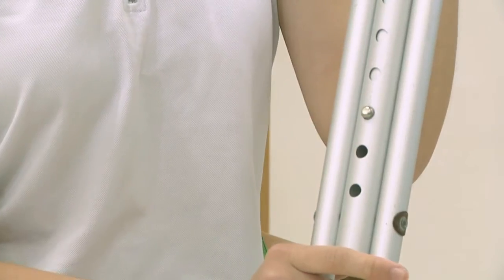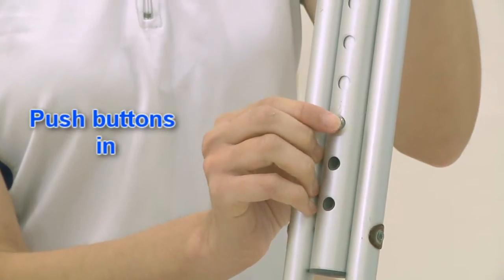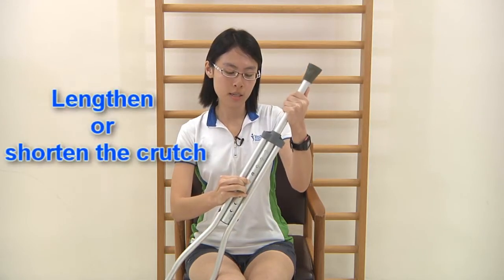To adjust the height of your crutch, locate the two silver buttons. Press on the silver button and adjust the height of the crutch accordingly.